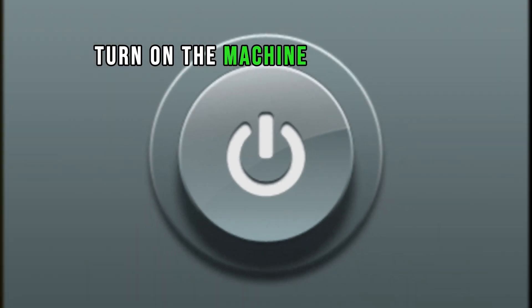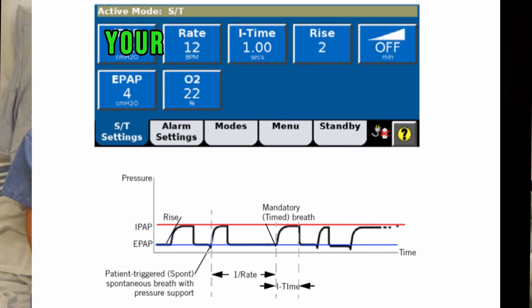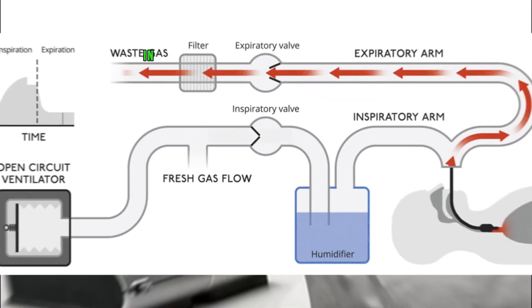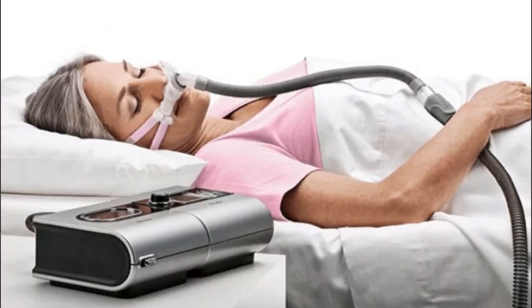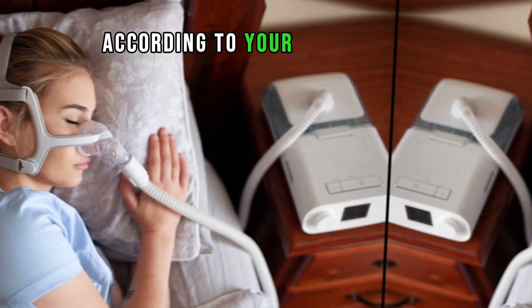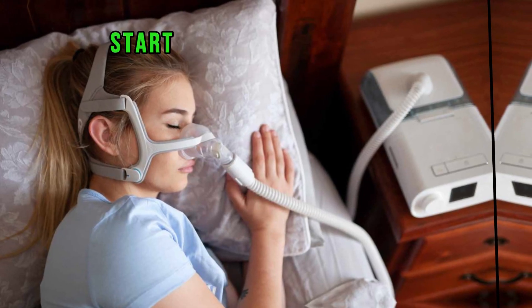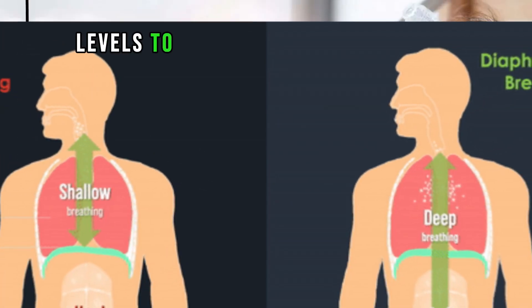Turn on the machine by pressing the power button. Adjust settings — your healthcare provider will have prescribed specific settings for your therapy, including the IPAP (Inspiratory Pressure) and EPAP (Expiratory Pressure). Use the controls on the machine to set these pressures according to your prescription. Once the machine is on and the settings are adjusted, start breathing normally. The machine will deliver the prescribed pressure levels to support your breathing.